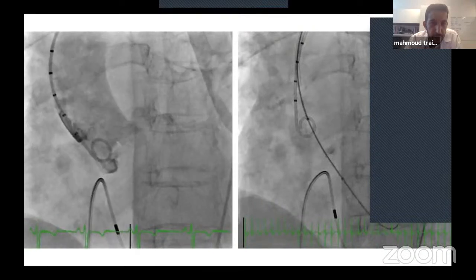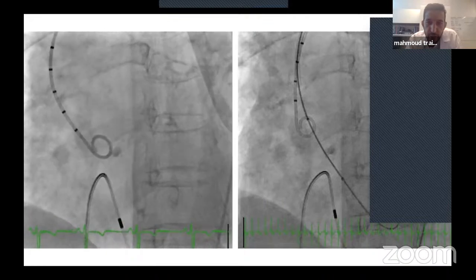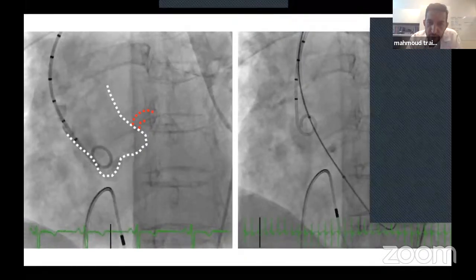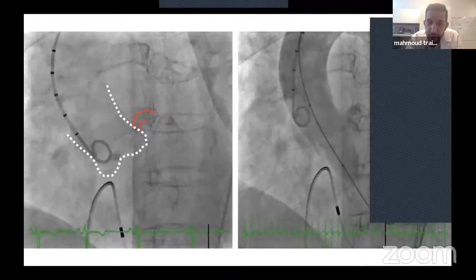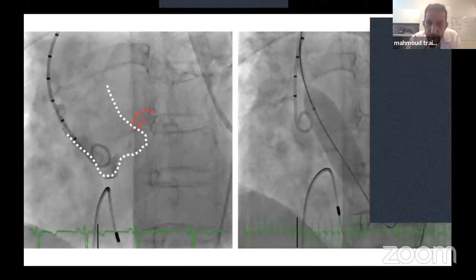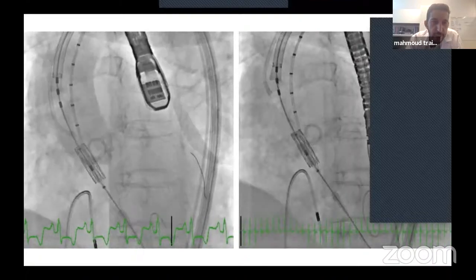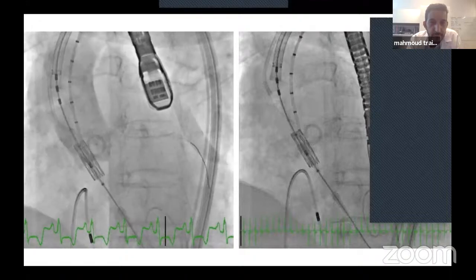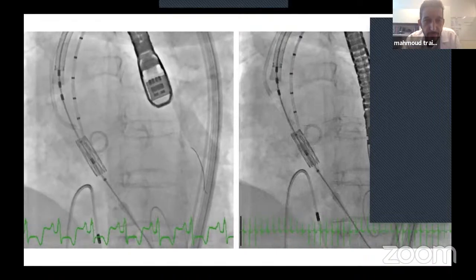This is that patient with very severe advanced aortic stenosis, high gradient, mean gradient over 60. When we look at the anatomy, you can see on the left there is a very low coronary height, which is concerning, but the sinuses are relatively large. We do a pre-dilation in these cases, a balloon, to see if we deflect the leaflet up, does it affect the coronary? We can still see on the left that the left coronary is filling, but it's a pretty small channel. So in a case like this, we decided to prep for a potential obstruction and place a stent into the coronary to have it ready in case there's a coronary obstruction, which would be an immediate and emergent situation.